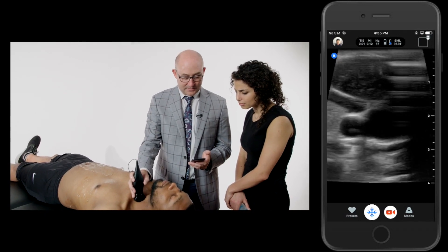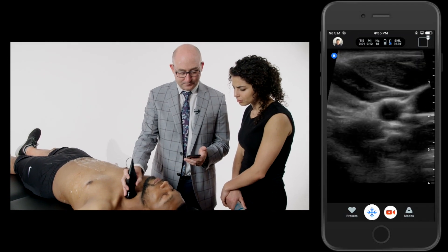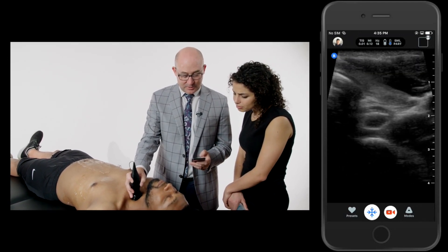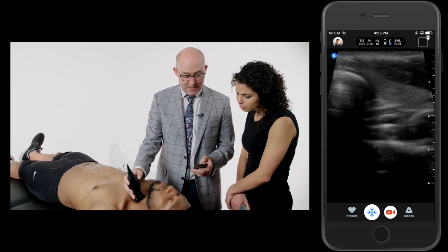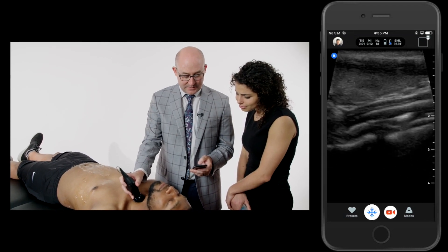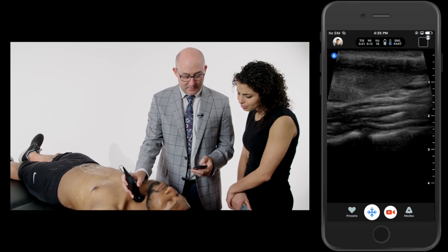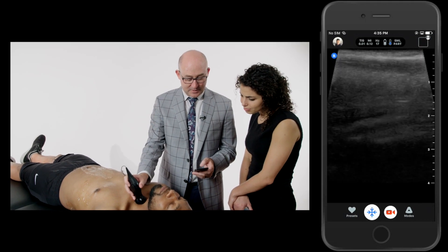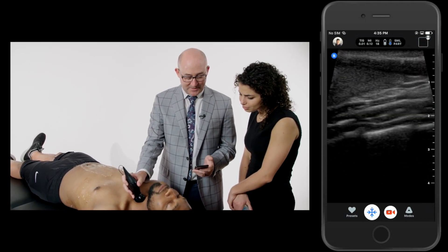I see his left carotid, his left IJ. Below that left thyroid is the esophagus, and I'm actually able to see the esophagus there directly underneath his thyroid — that's a short axis. I'm going to go long axis on that esophagus now, and we can see that esophagus stretch out across the screen. There's some air in it as well — almost like a B-line or two from the air-fluid interface inside the esophagus.